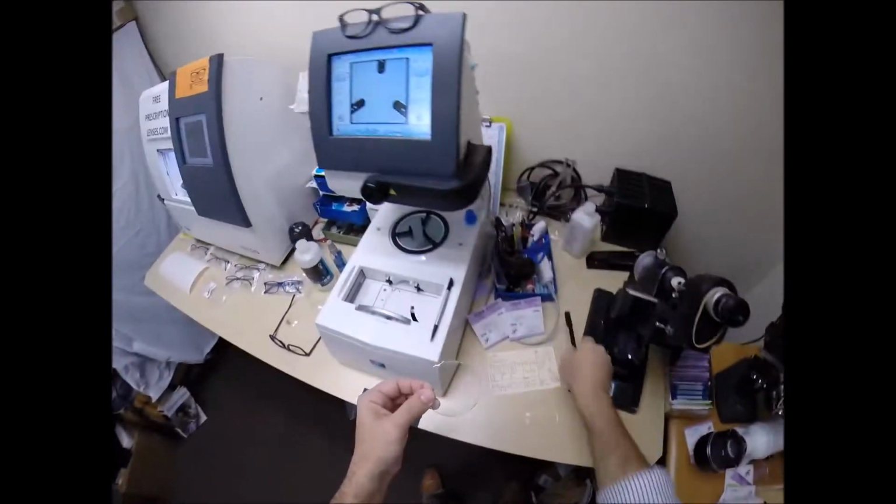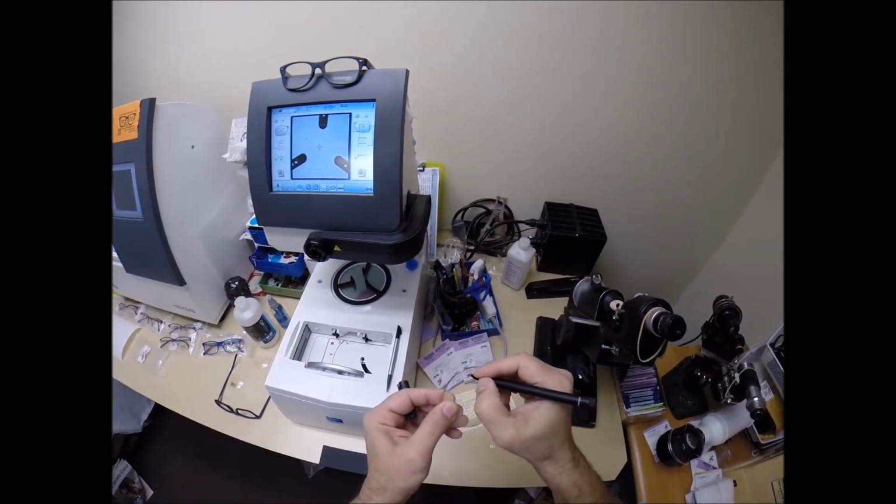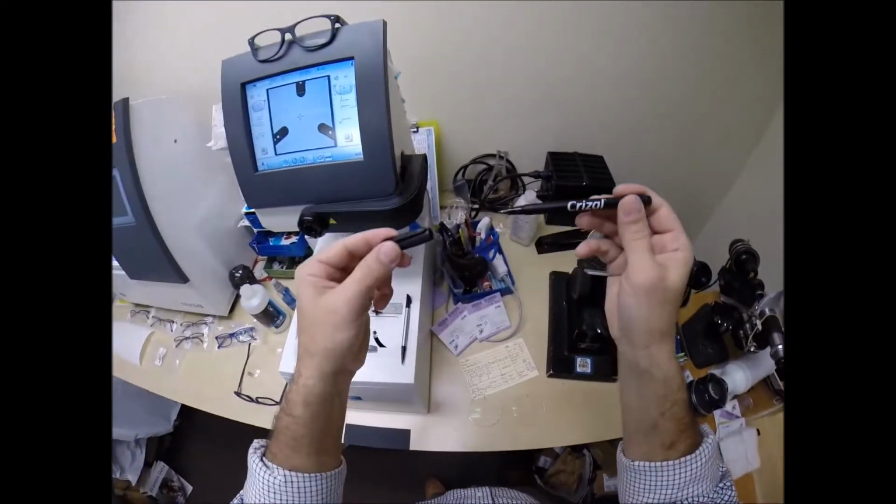And we'll put 3 dots on that lens. How about that? The smudge is up higher this time. And put an L on there for left. And for those of you who weren't paying attention, let me recap.